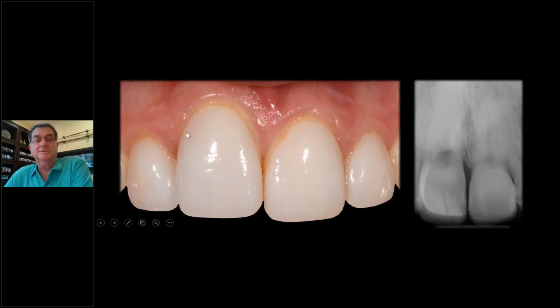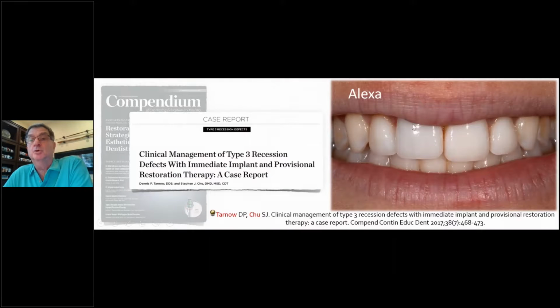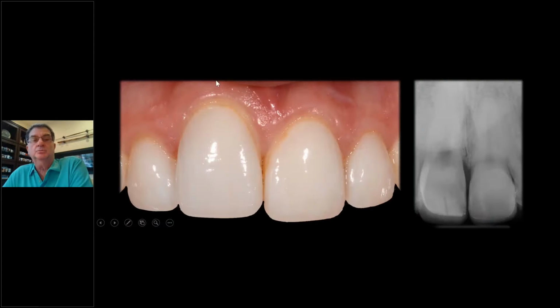So what bothered her was not the gingival heights. It's interesting. The gingival height was not a problem. She didn't show it. Remember? She didn't show it. She said, I don't even look at that. I look at the incisal edge, she said. I said, well, what if I don't bring this tissue down? I might be able to put an implant in the same day, and we can level this off. That's easy with the new temporary and the new crown.